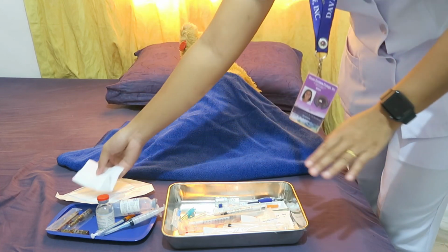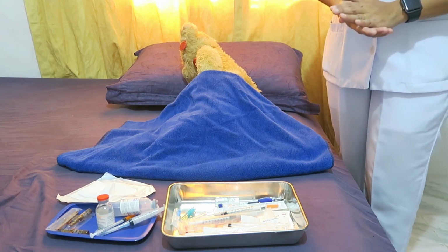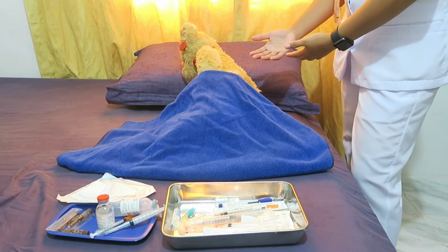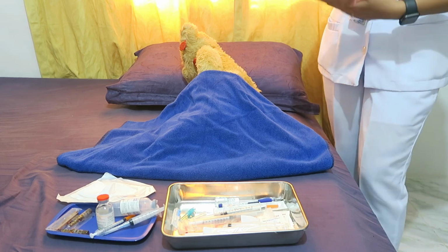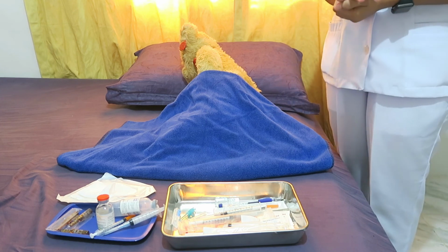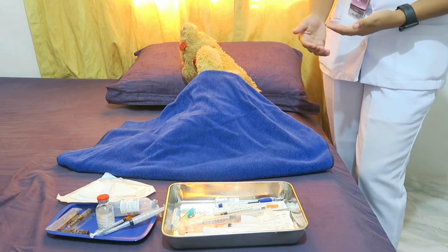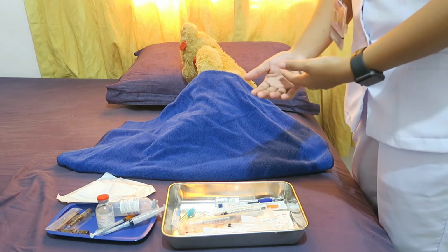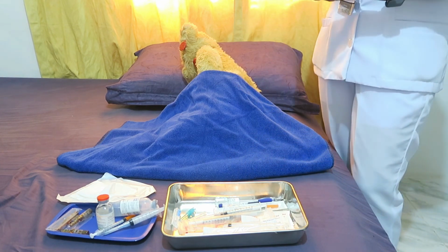Okay, then discard. If bleeding occurs, apply pressure with a dry sterile gauze until it stops. As we can see, there is no bleeding, so we continue. Next is to activate the needle safety device or discard the uncapped needle and attach syringe into the proper receptacle. As you can see, I've already discarded the syringe that we used.